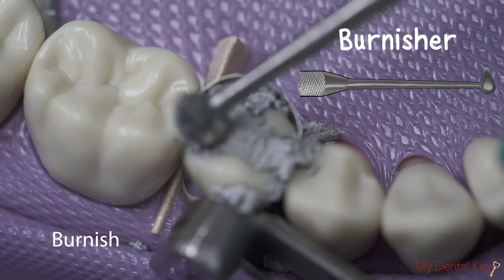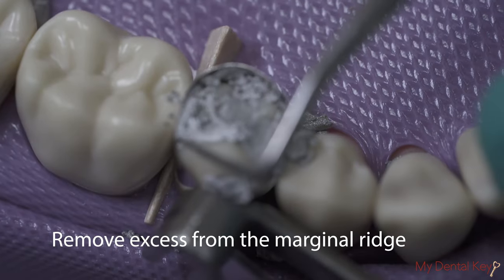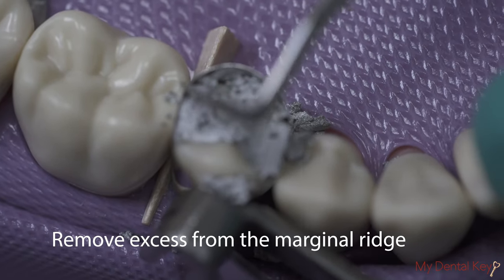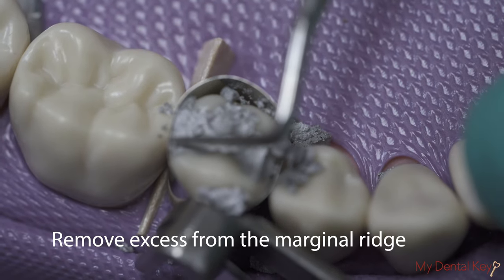Firmly burnish the amalgam with the round end of the burnisher. Use the explorer tip at a 45-degree angle to the matrix band to remove excess amalgam from the marginal ridge.